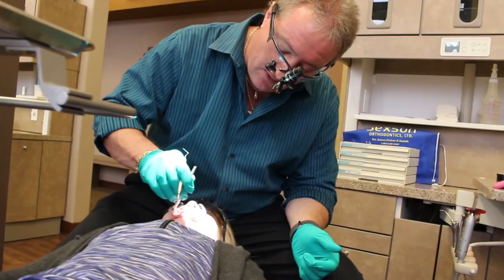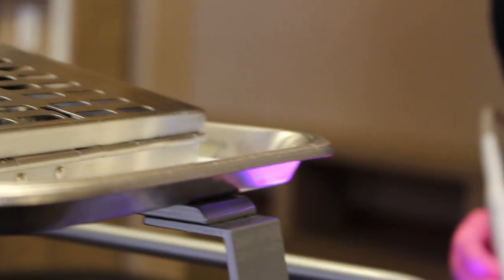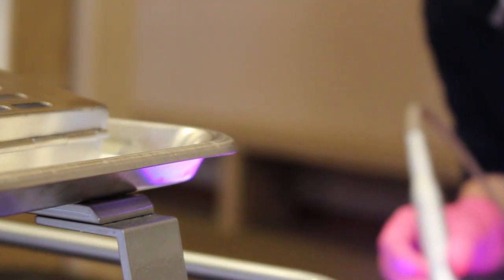Each brace is specialized for each tooth, and how and where you place it on the tooth affects how the teeth are going to be moved. Once the braces are placed, we use a light-cured cement — a certain type of light helps set them up and make sure they get nice and hard.